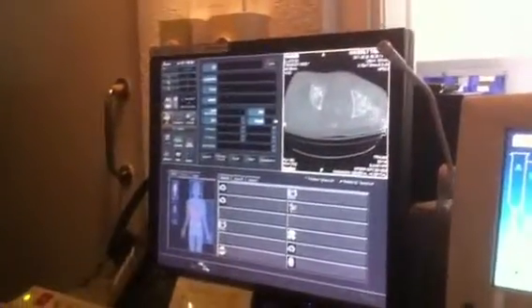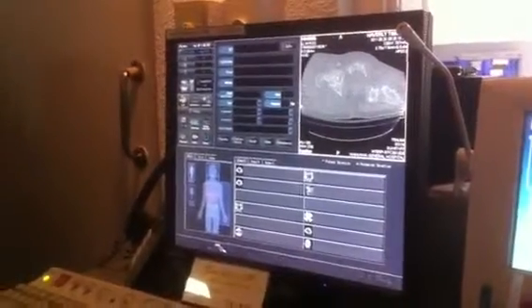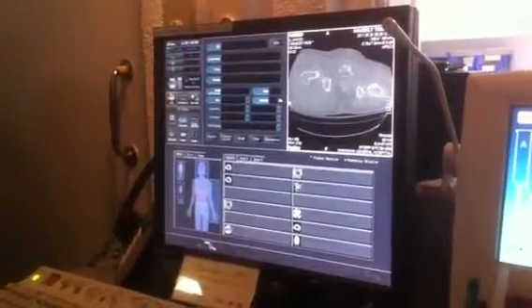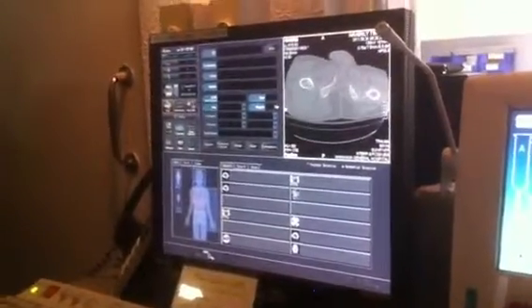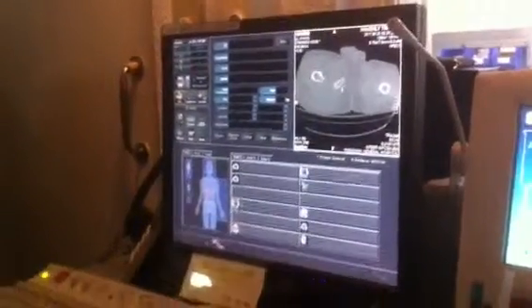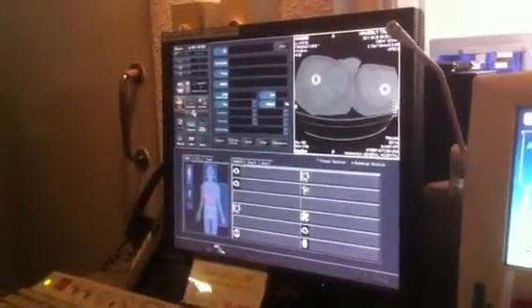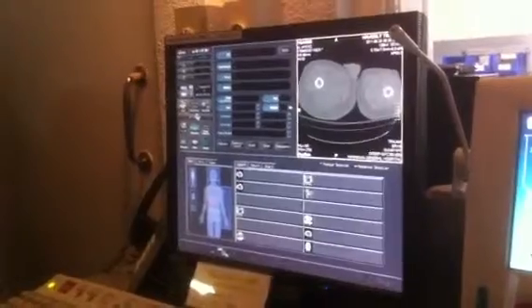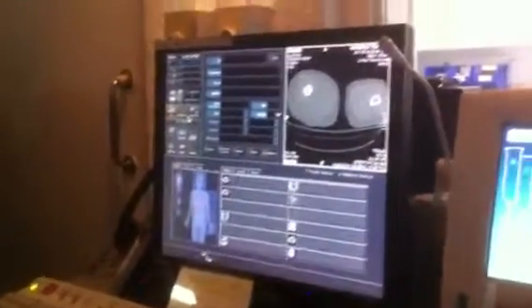And the reason for picking the 7s, I mean, you could have picked anything? You could have picked anything, but we're in a hurry, so we're going to do 7s. Yeah, running out of disk space. Hurry up. I deleted a lot of crap off of my phone last night. That's close. Lost all his family pictures for this. Okay, so you want me to back up some? No, get to the boost.